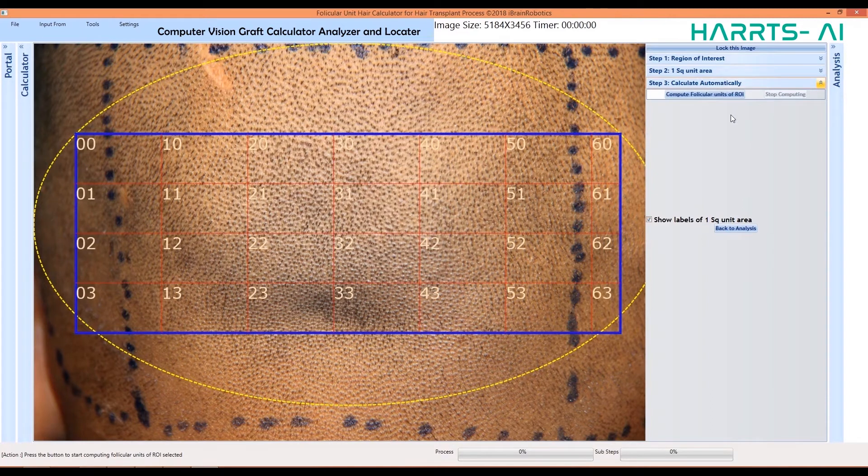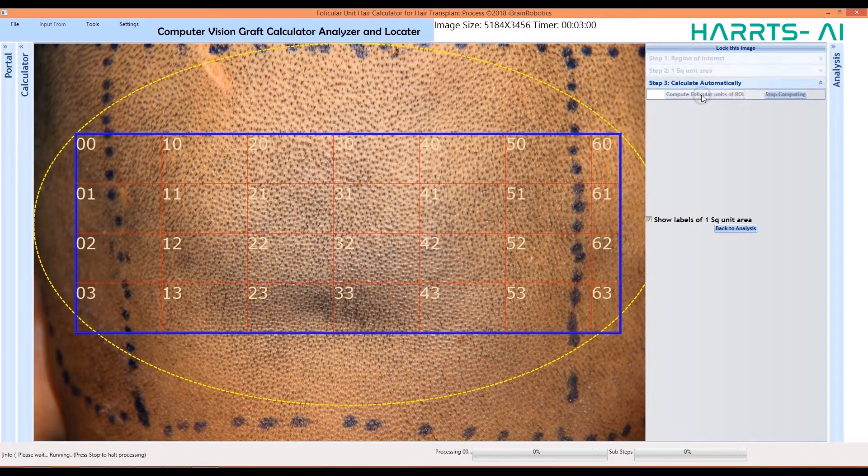The system can define the value of each square unit area automatically, through its artificial intelligence software. Once you have defined each square unit area, click on Compute Follicular Units of ROI to start the details of grafts in the area of interest.